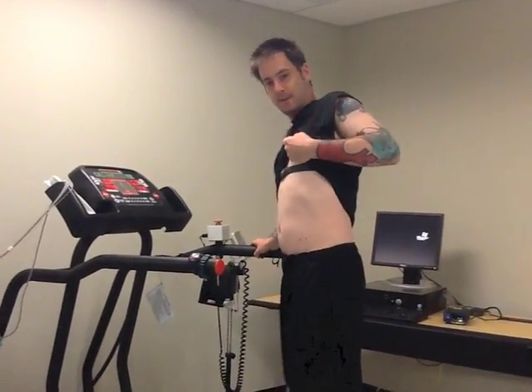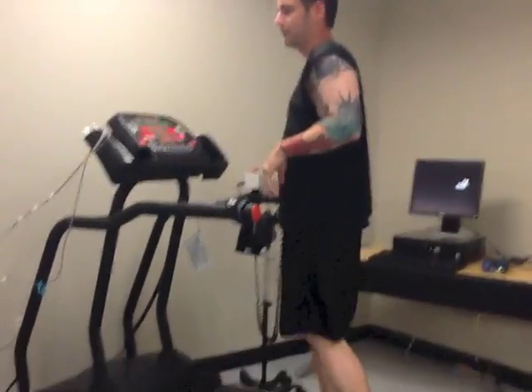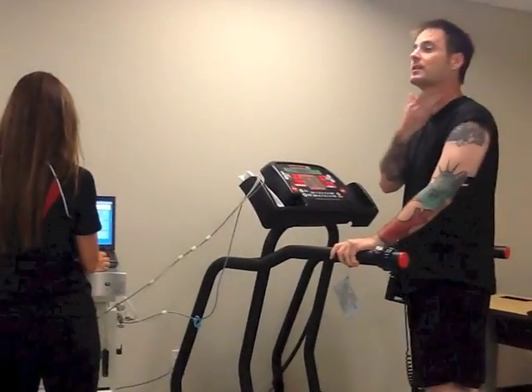This is a heart rate monitor. You'll be able to see what my heart rate is doing because it'll be jumping.